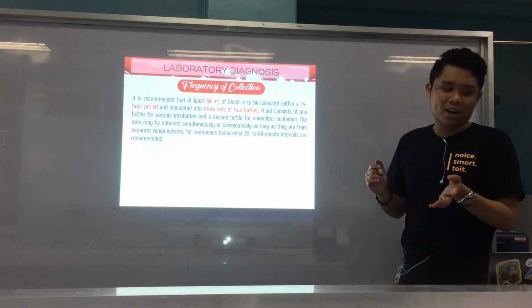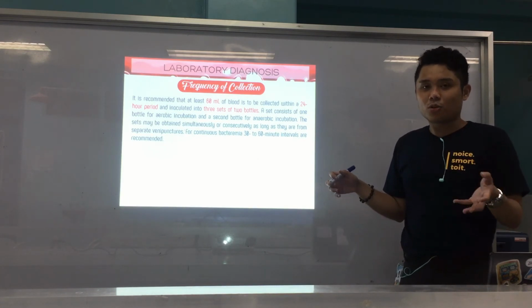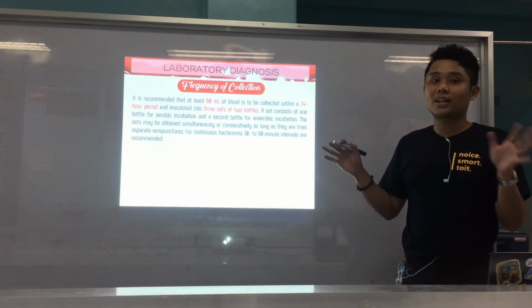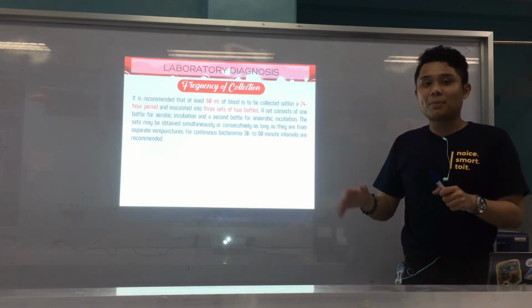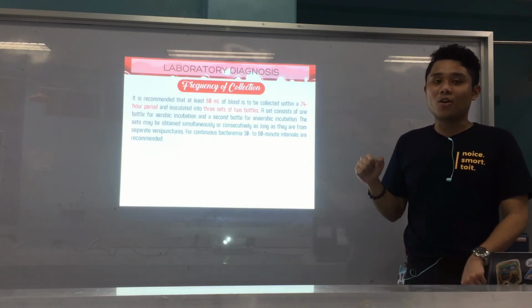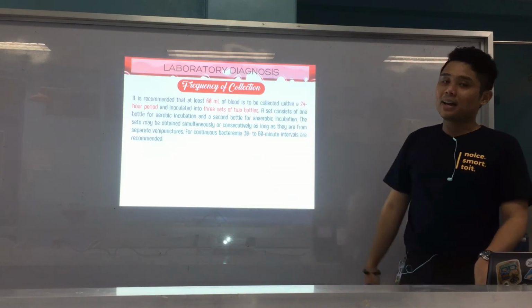So what if ang kagaw na nag-cause sa bacteremia is an anaerobic bacteria? That could be possible because your blood can be a source of anaerobic bacteria. Or what if aerobic bacteria? So mas okay na naa tay option for the 2. Alright, so mao na naay 2 bottles for each set. And within 24 hours, dapat naa tay 3 sets. So therefore, naa tay 6 ka bottles all in all. Okay? 6 ka bottles all in all. And each bottle contains 10 ml man. Or 10 ml man dapat imo i-collect. So therefore, mao nang 60 ml atong i-collect.